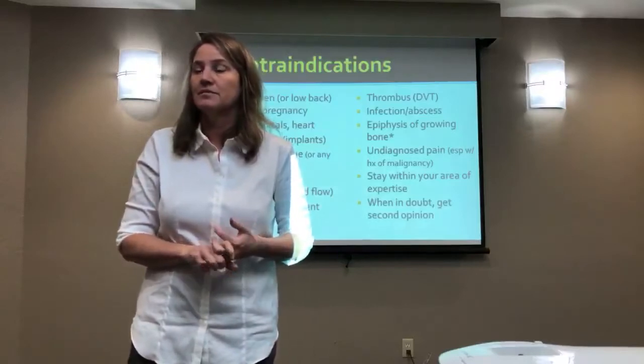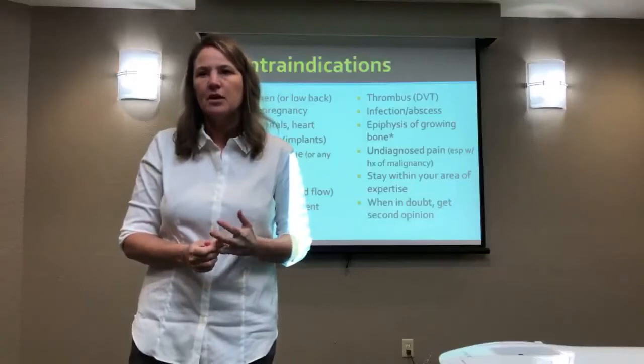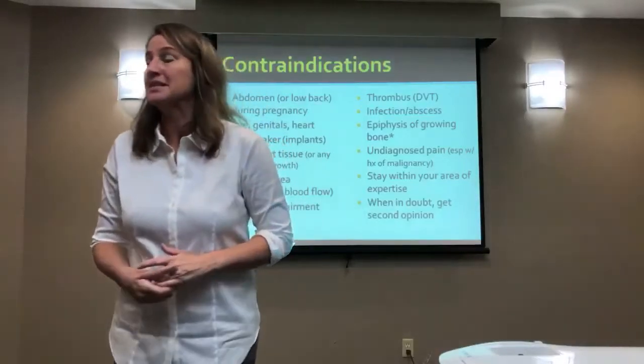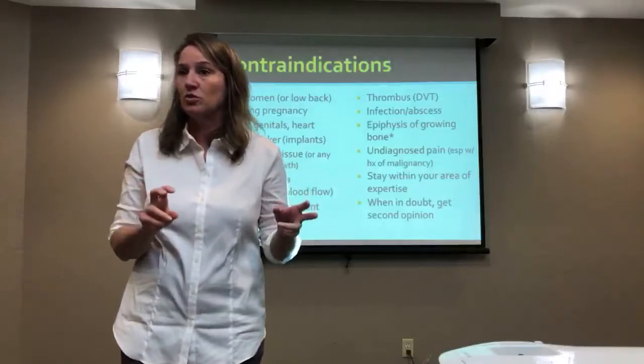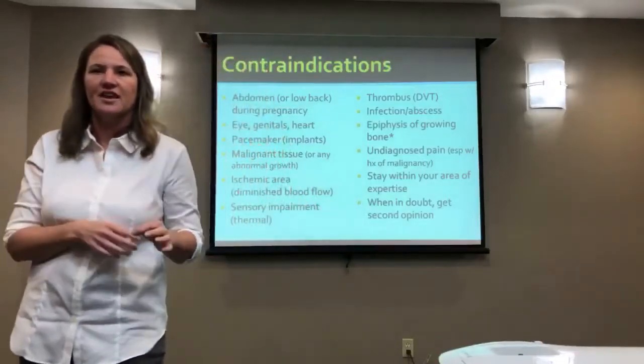Can aides or assistants do the modality in Florida? No. Can aides or assistants? No. I mean, ultrasound is used... Assistants can. Oh, like a PT assistant or a COTA assistant? Yes, absolutely. A tech or an aide, a non-licensed individual, no. So a non-licensed person. I mistook that word, yes.